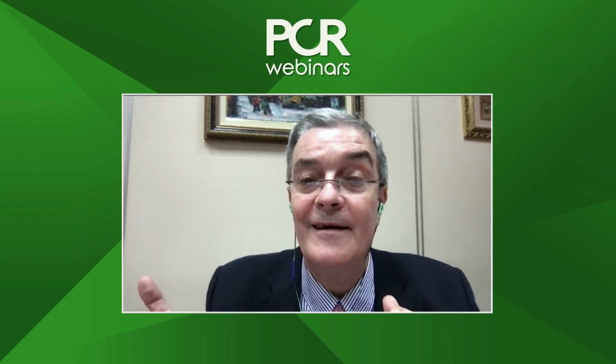And I like very much the trick explained by Prof. Tan, that he is also using a jailed wire, but in this case trying not to have a gap between two wires and actually focusing the attention to go parallel with that jailed wire. Prof. Tan, please explain the concept of sequential crushing. People are afraid if you are using a large balloon for sequential crushing. How are you deciding on the balloon size and what is the concept behind the sequential crush?